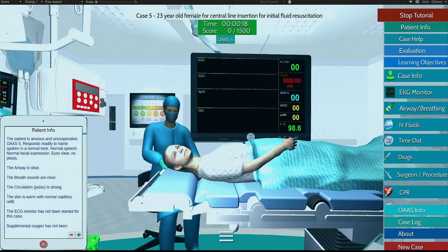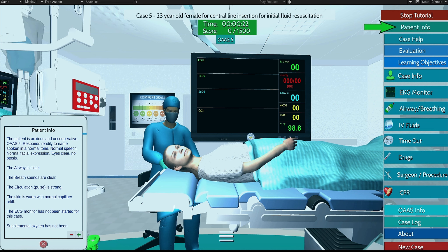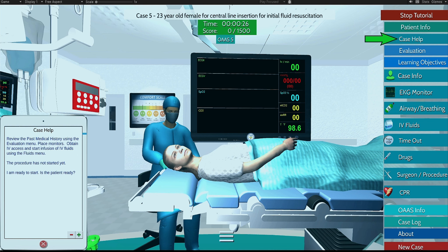This is your case info menu. This is your patient info — please review frequently for patient updates. This is your case help, which gives you tips to help you with your case.